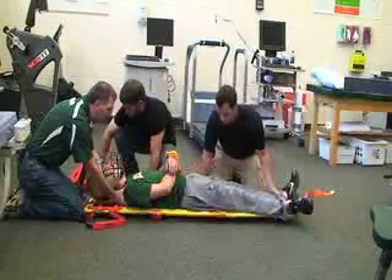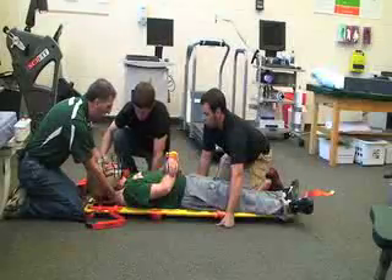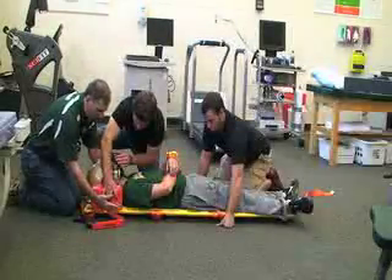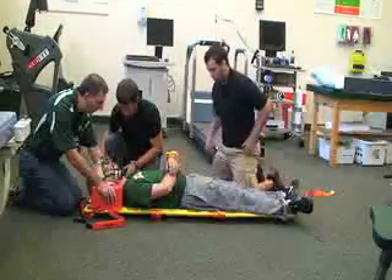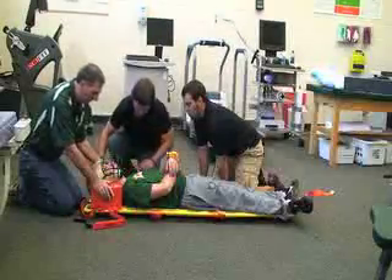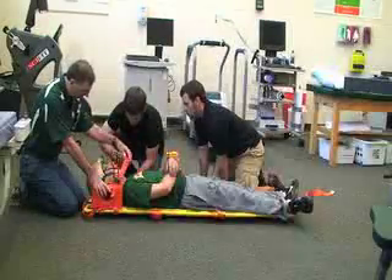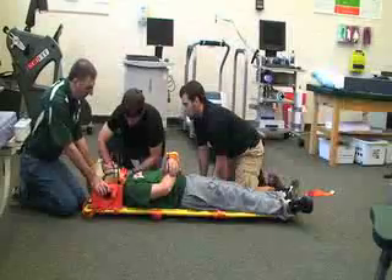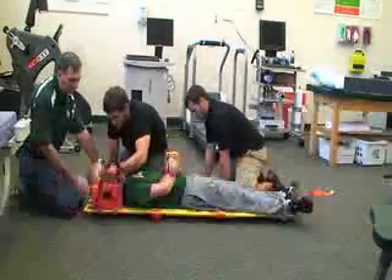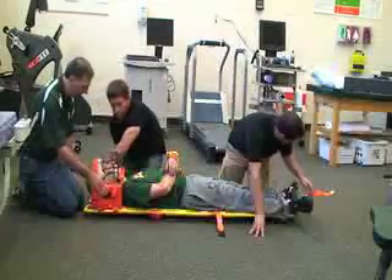Once we're in this position, we're going to go ahead and put one of our head immobilizers on. While he's doing that, I'm trying to maintain head stabilization until he's ready to go. Once those are in place, we're going to go ahead and attach one strap across the chin. If we need to adjust the Velcro on either side, we can do that. Then one will go across the forehead — adjusting the slack as needed.